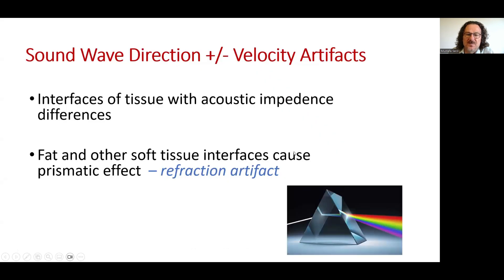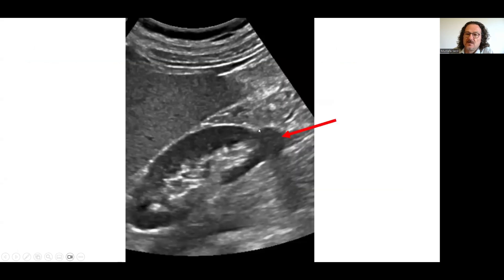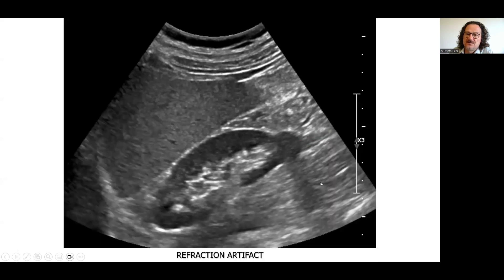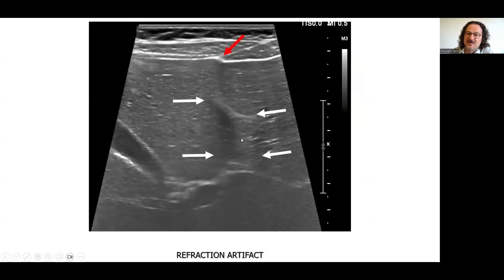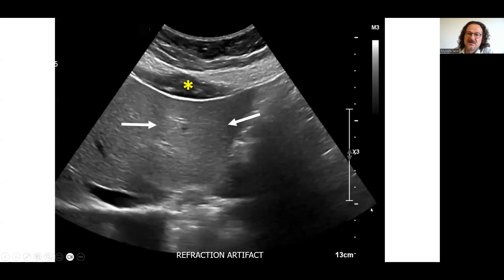Interfaces of tissue with acoustic impedance differences may cause artifacts. Particularly, fat and other soft tissue interfaces may cause a prismatic effect called the refraction artifact. Here you can see a pseudotumor occurring because of the fat interface with the spleen, and refraction making an image that looks like a tumor of the lower part of the kidney. The preperitoneal fat is a common location for refraction artifacts, and you can see the prismatic effect here.